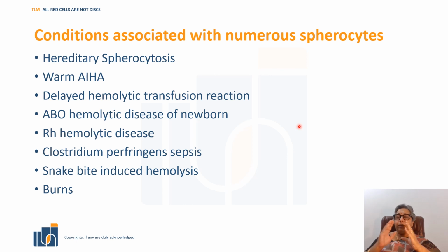If you look as you move from the ideal zone away towards the tail, you're going to find a reasonable number of cells that are spherocytic in nature, which is mainly because of the smearing. So that is not the place where one would look for spherocytes, because if you start looking towards the tail, almost everybody will have spherocytes on their smear. So you have to look at everything in the ideal zone. For morphology, that is the area where one should concentrate.